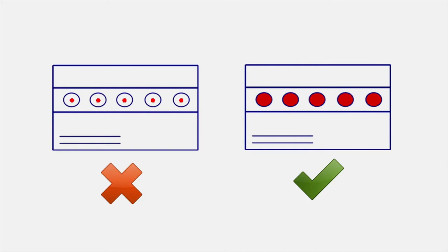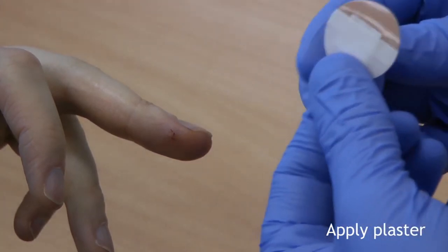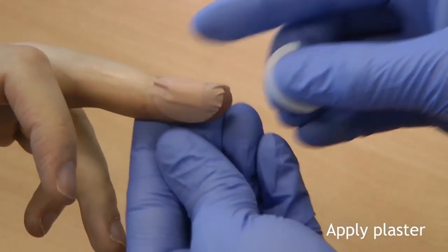Please try to fill each spot with blood as this ensures the highest test accuracy in the laboratory. If getting enough blood is difficult, use the second lancet and repeat the procedure. Once you have taken the samples, apply the plaster to the bleeding finger. Please try and ensure no blood gets onto the outside of the card or the form.